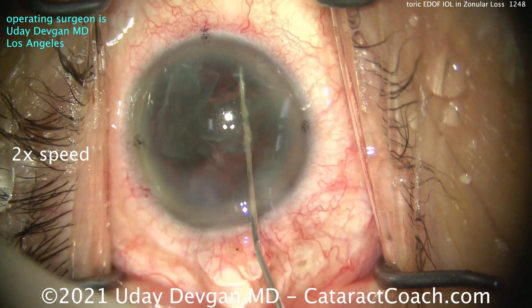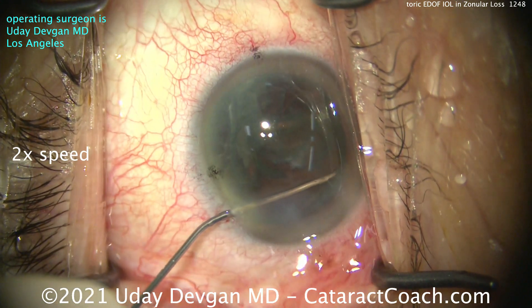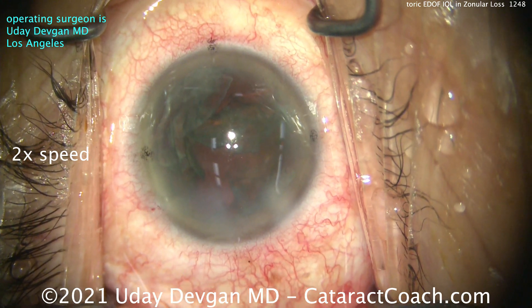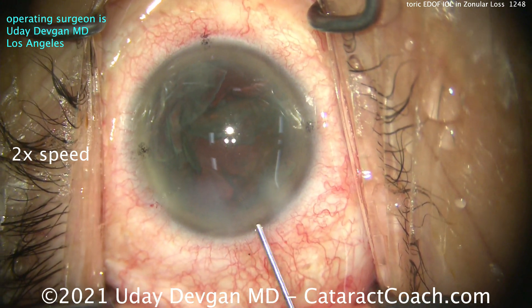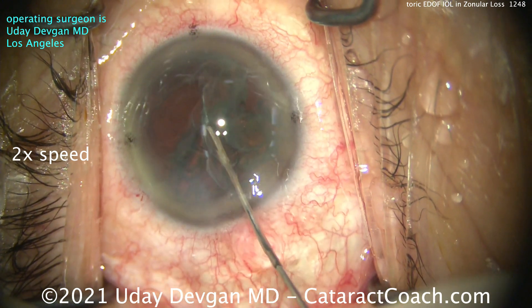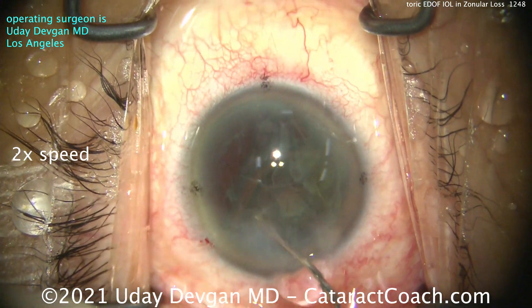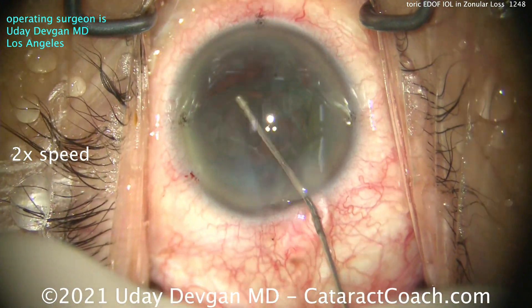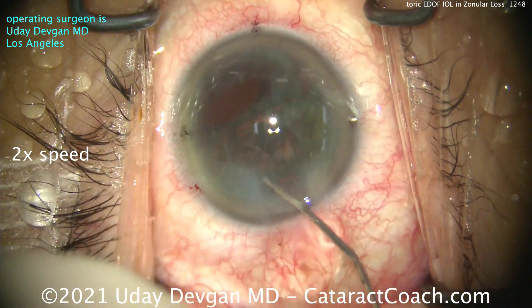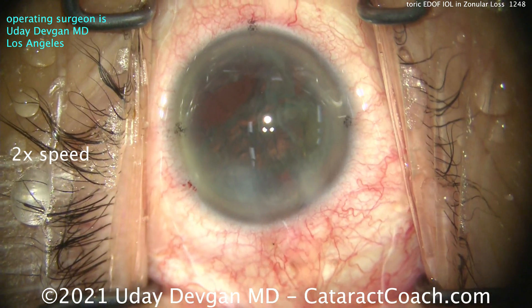I liked the technique of getting the endonucleus out while leaving the epinuclear shell to protect things — I thought that would help weigh things down. Now what are we going to do? Because we saw that there's probably at least three clock hours of very weak or actually absent zonular support. So let's use viscoelastic — I don't mind spending money. Let's get this big epinuclear shell up out of the bag and into a position where we can aspirate it down.